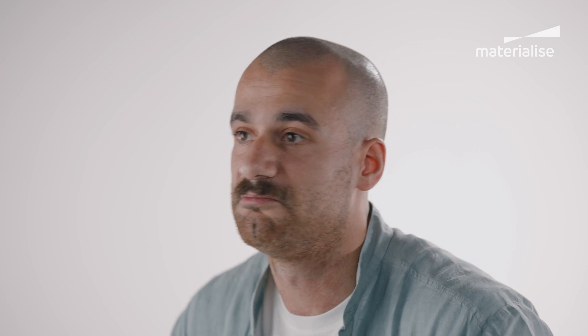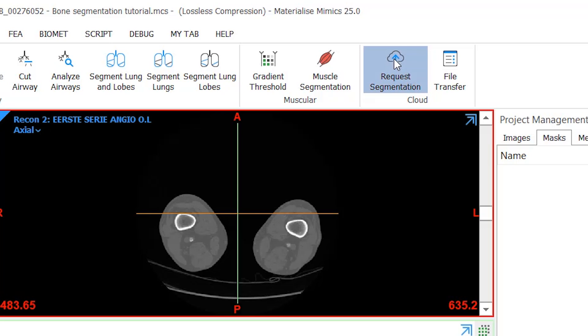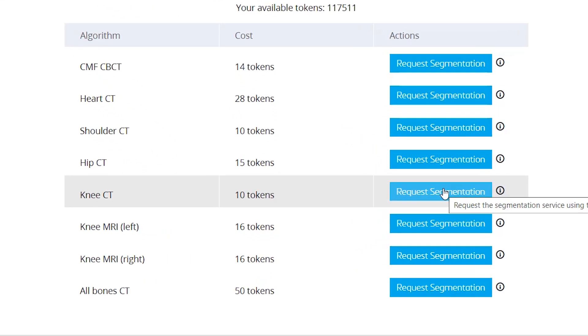This cloud-based tool is accessible from any laptop or computer with an internet connection, and it's ideal for companies scaling up their personalized solutions because they won't need to invest in special hardware. What I find very convenient is that you can let it run in the background while doing something else — the algorithm segments the results for you. In the Mimics project, go to the advanced segment tab and select request segmentation. After clicking on the desired automatic segmentation type, the algorithm will start running in the background and you can work on something else.